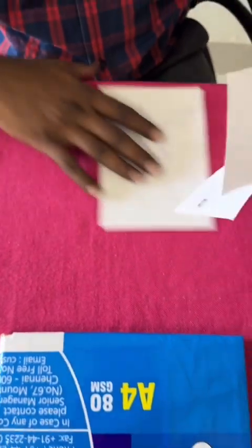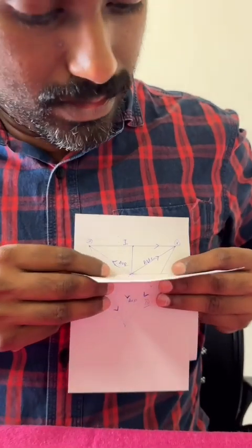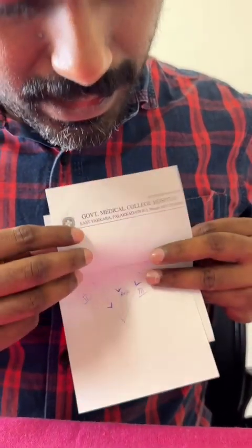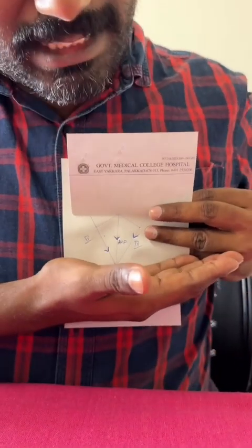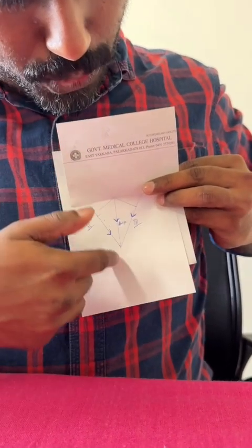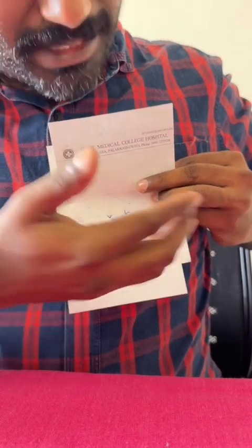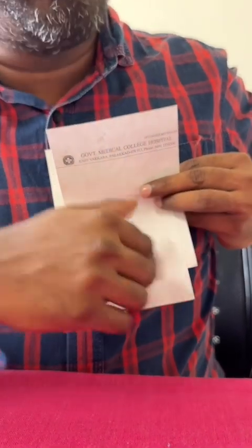So when we combine this together, this will be looking like this. Okay, so when we look at the inferior wall, which all leads are pointing towards this? We have 2, 3 and AVF pointing towards the inferior wall. So the inferior wall is represented by 2, 3 and AVF.